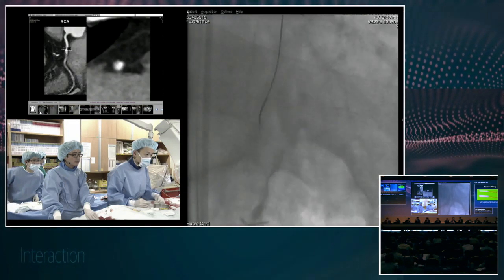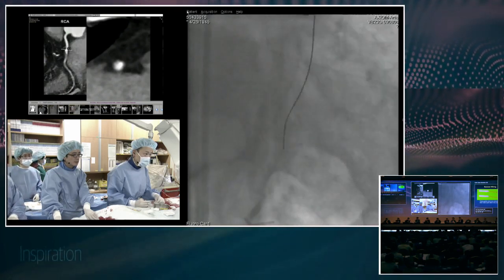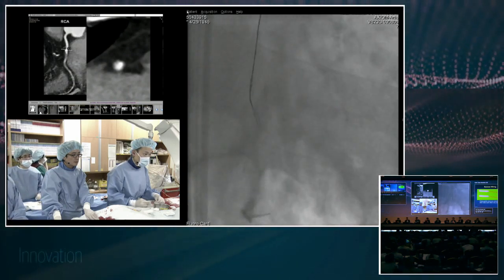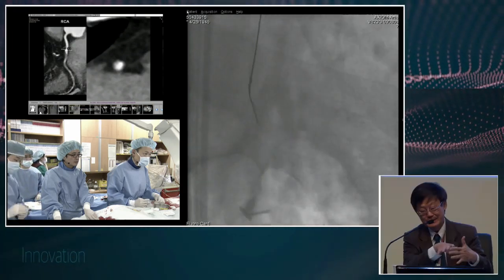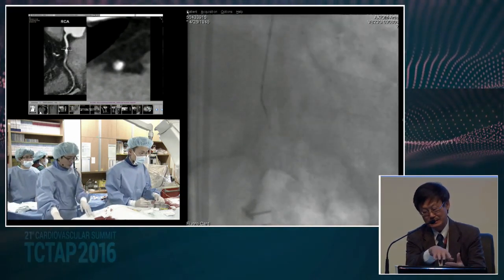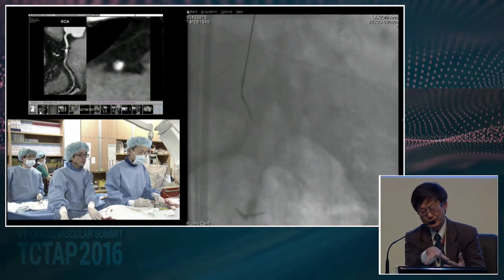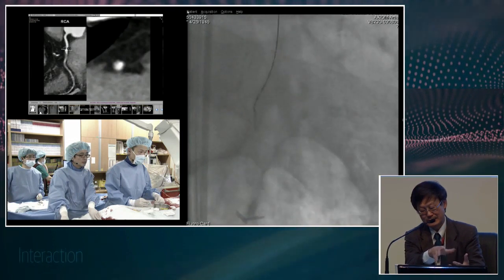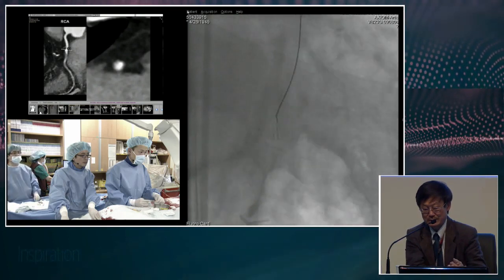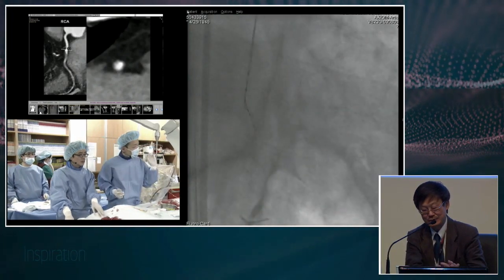Even though this is a very short segment, it's the best way to prevent distal dissection, more extensive dissection. But for me, I will step to retrograde, because if you extend your dissection somewhat beyond the trifurcation, then you might compromise the three major branches. That is not the goal we like. If the short trial is like this, you already know that it is not successful. So we should consider retrograde as the better way, because I don't want the subintimal space expanded beyond the trifurcation.